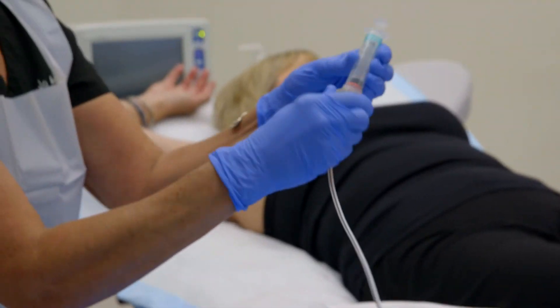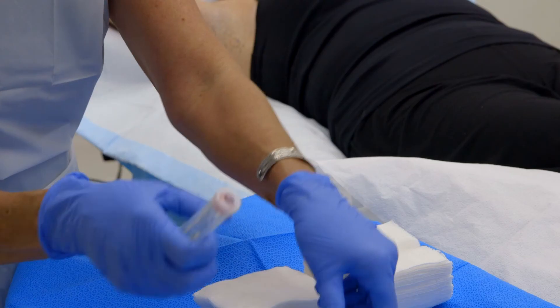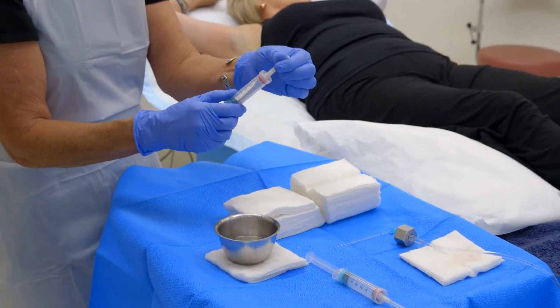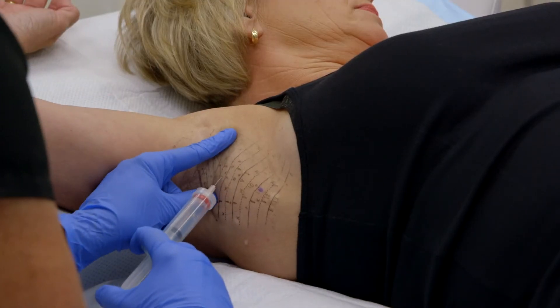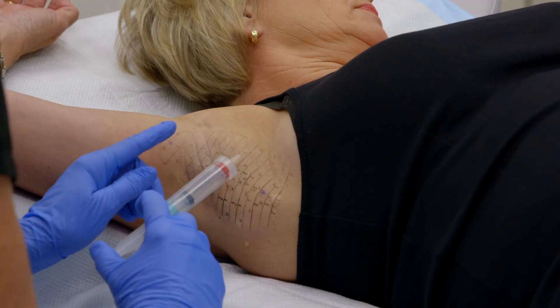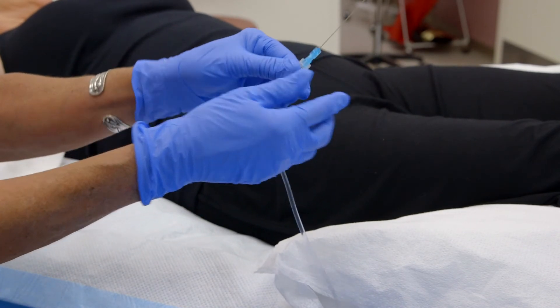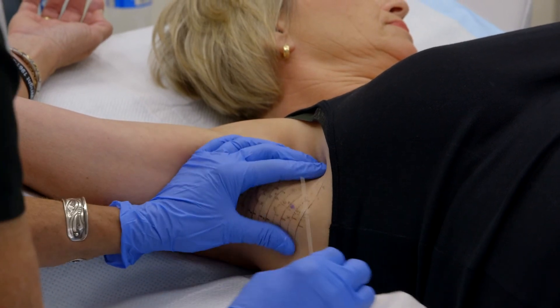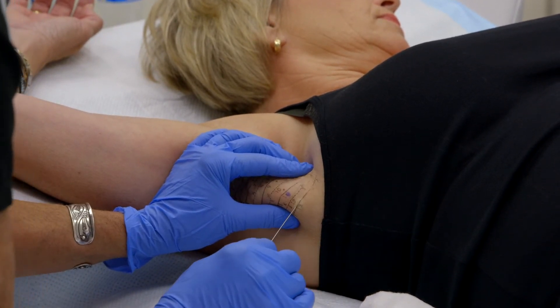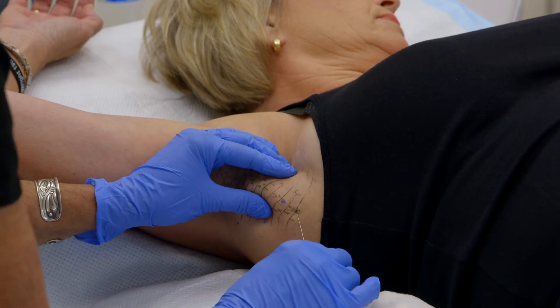Fill both 5cc syringes with tumescent solution, then attach a 30-gauge needle. Inject 4 to 5 intradermal 1-milliliter blebs of tumescent solution using a 30-gauge needle. The spinal needle will be inserted through the bleb into the subcutaneous tissue. Attach the spinal needle to the HK tumescent infiltration tubing. The clinician's non-dominant hand gently grasps and slightly elevates the axillary skin, while the dominant hand holds the spinal needle. The needle is inserted through the bleb and then advanced within the superficial subcutaneous tissue using a gentle in-and-out motion in a fanning pattern.